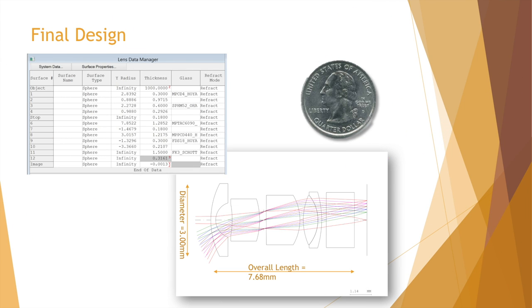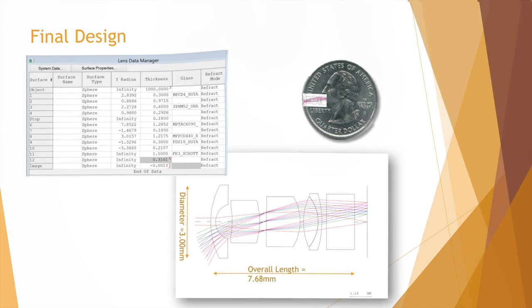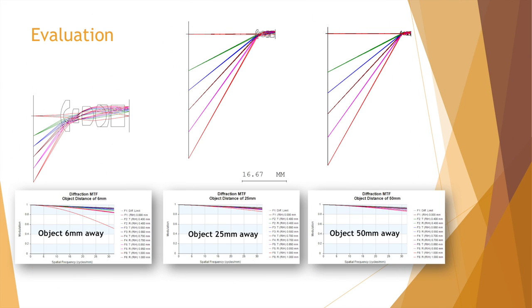The final design has an overall lens length of 7.68 mm and the largest lens diameter is 3 mm — smaller than a quarter coin. To further verify that this optical system works well, we change the object distance to 15 mm, 25 mm, and even push to 6 mm, which is 1 mm shorter than our target distance. The modulated transfer function fully meets our expectation of having more than 50% contrast at 32 line pairs per millimeter.